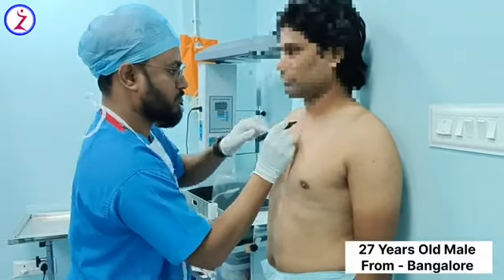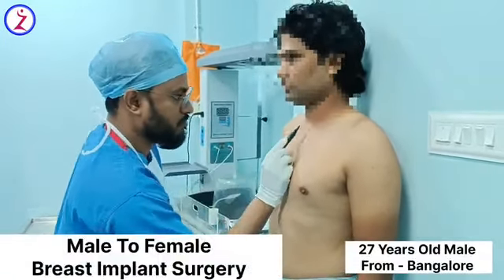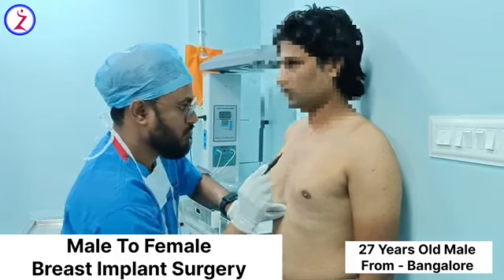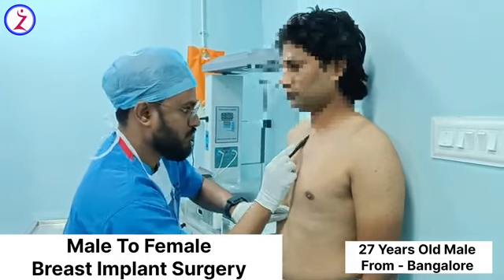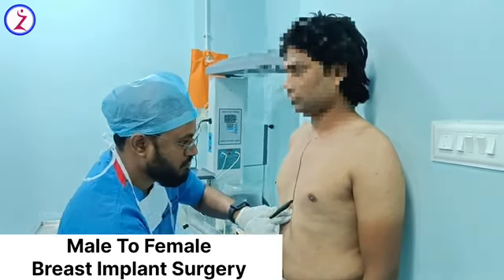This is our 27-year-old trans female patient. She had come for feminizing surgery. Today we are planning to do feminizing top surgery. Feminizing top surgery majorly involves breast augmentation.